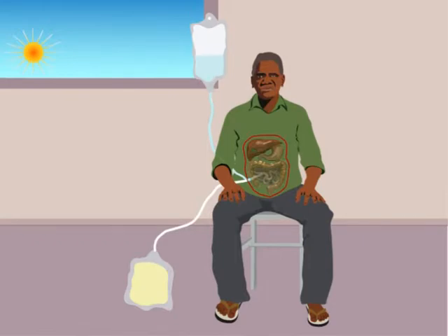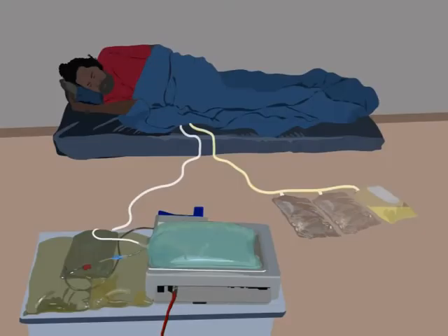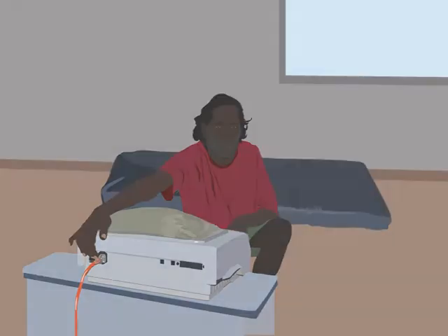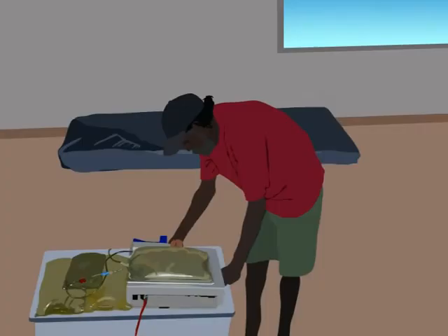You can do PD during the day or overnight. If you do PD every night, a machine will control the way the dialysis water goes in and out of your peritoneum. You need to set the machine and bags up before you go to sleep.